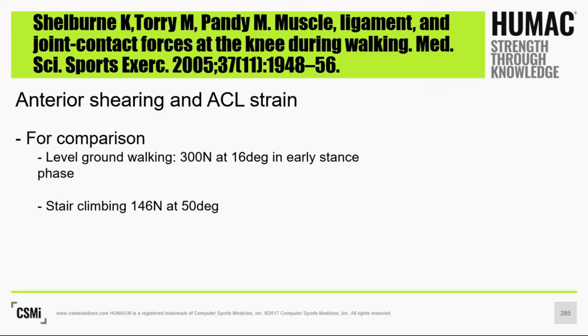For comparison, when you walk, every step you take, you engage the quadriceps at heel strike, which keep in mind that's a closed chain position. The ACL is getting a 300 Newton load. And we don't tell our ACL reconstruction patients not to walk, right? We typically have them walking without crutches and even out of their braces around household distances between weeks 4 and 6.